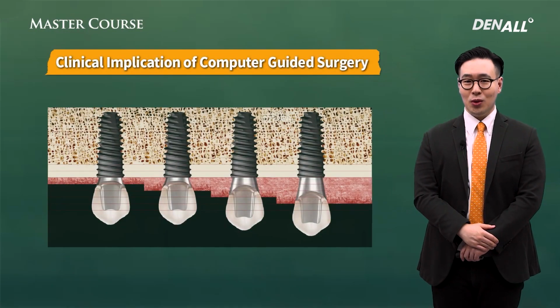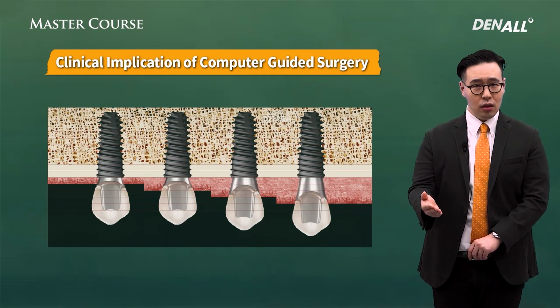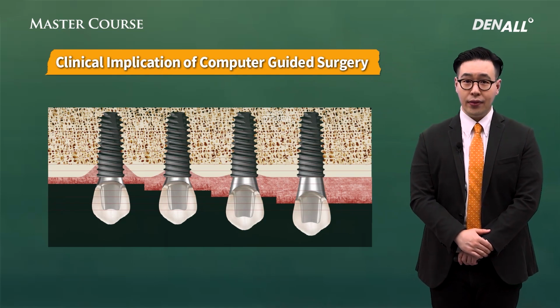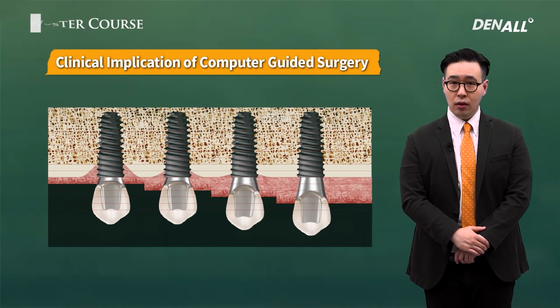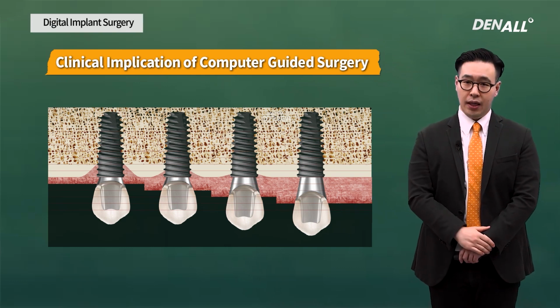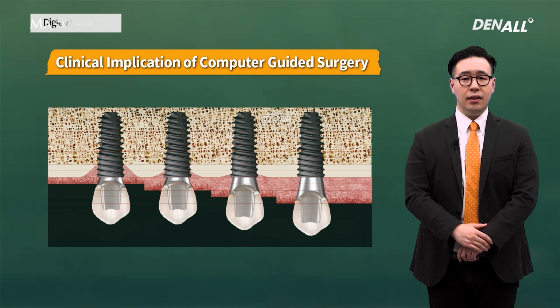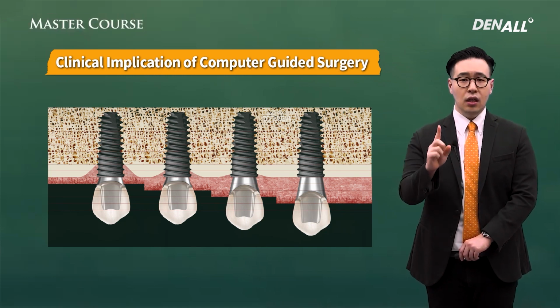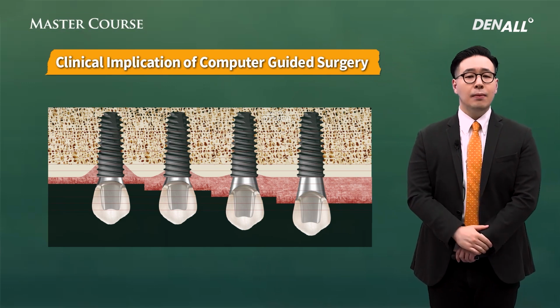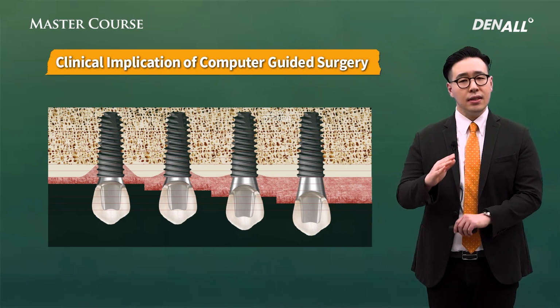So, if the thin soft tissue is not properly identified and the implant is placed aligning with the bone surface, as soon as the healing abutment or temporary prosthesis is connected, biologic width kicks in, causing bone resorption. This should be remembered. The first rule is to place 1 millimeter deeper than the bone surface. The second rule is to calculate the soft tissue thickness. Clinically, when busy, this is frequently overlooked. That's the big difference.